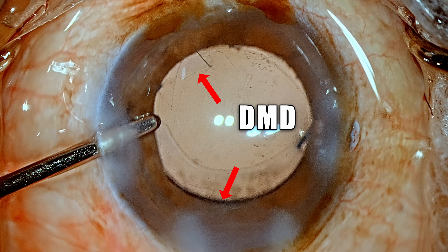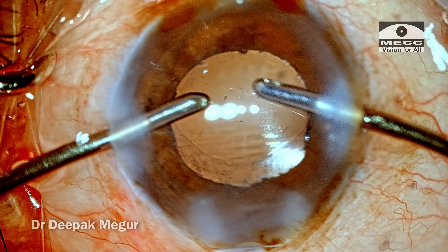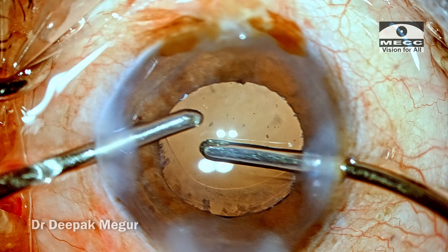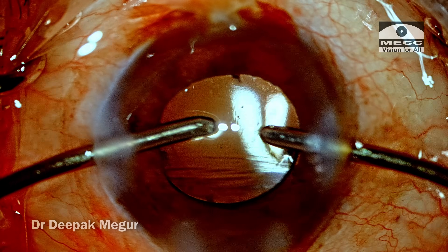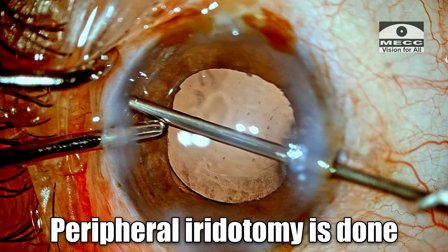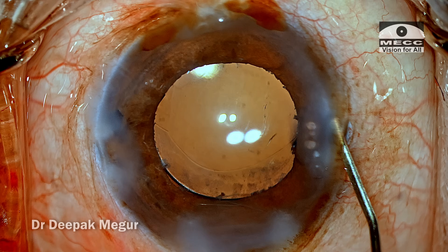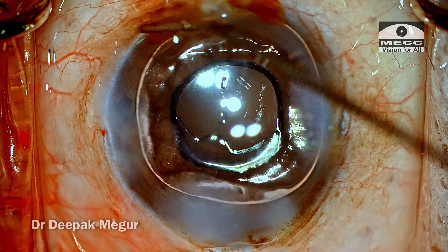As I'm trying to remove the OVD, there is a clear hint of a small Descemet membrane detachment at this area. There is OVD in the anterior chamber which needs to be aspirated. I'm not sure at what stage it happened — maybe during engagement of the pupil expansion device or with the Sinskey hook when I was doing so. Nevertheless, it has to be supported by air, which I'm going to do. The wounds are hydrated. Because there is a small DMD to take care of, I'm going to place an air bubble inside the eye and hopefully it should support it well.